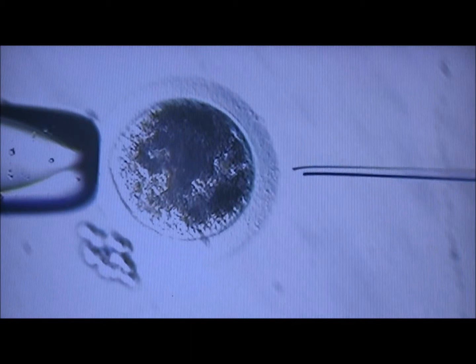Then we move to the egg drop where the egg is held in place by a holding pipette, rotated until the polar body, which is half the chromosomes from the maternal egg, is placed out of the way.